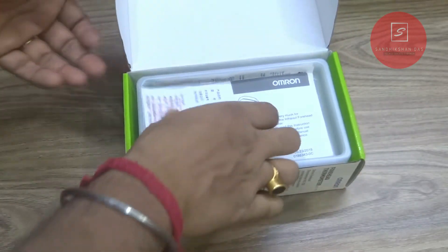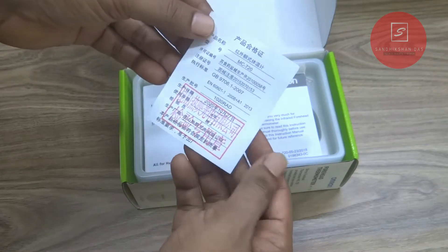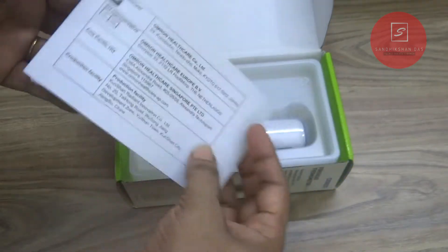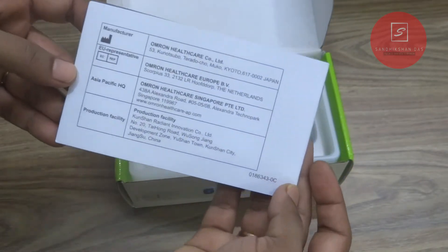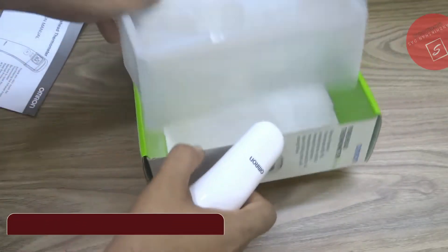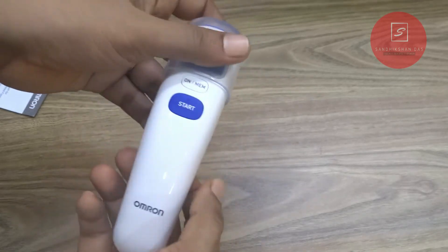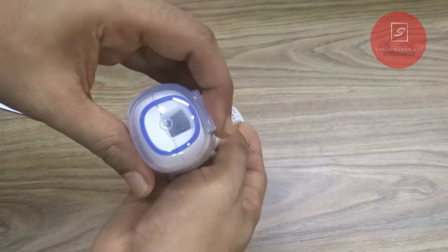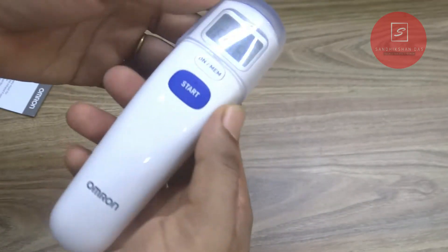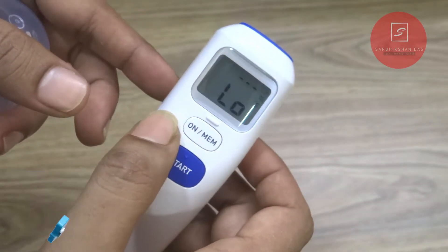Inside the box, there is one card written in some unknown foreign language, maybe Japanese or Chinese; one instruction manual which you must read to know more about this thermometer; and the beautiful dolphin-shaped Omron thermometer device. If I talk about its design and build quality, it is very good and solid — no flimsy material has been used. It has only one color variant, so you need to protect the white color from dirt. The thermometer has one big LCD display on top with a backlit that is very helpful at night.